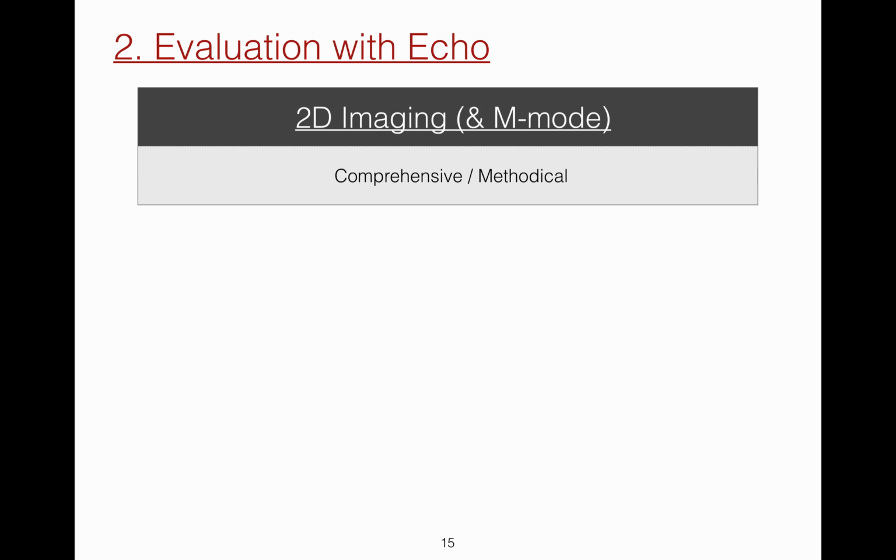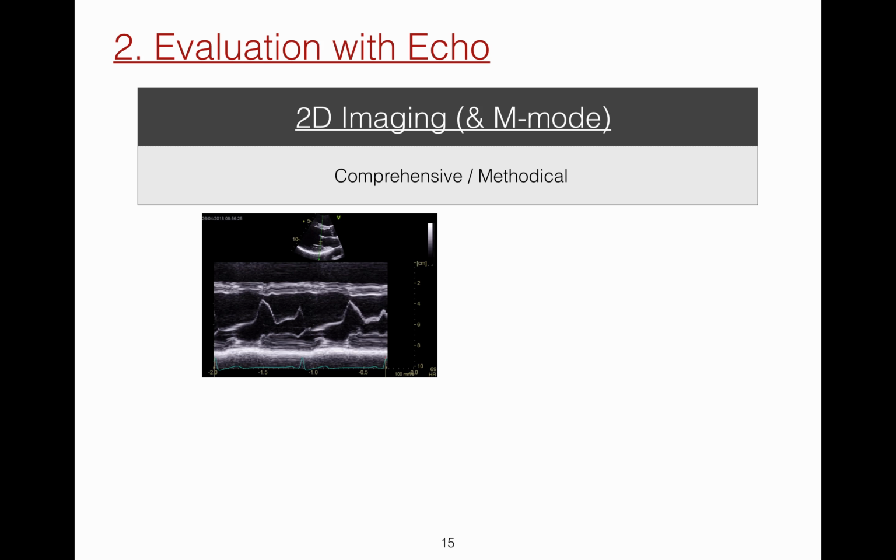As 2D imaging enables real-time images and measurements of cardiac anatomy and function, 2D is essential for assessing valvular anatomy and function. Moreover, it can be used to guide M mode, so as to place the cursor where it should be placed. M mode should be used for evaluating the valves, for example, to assess mitral leaflet motion, which can be very clearly displayed with M mode.